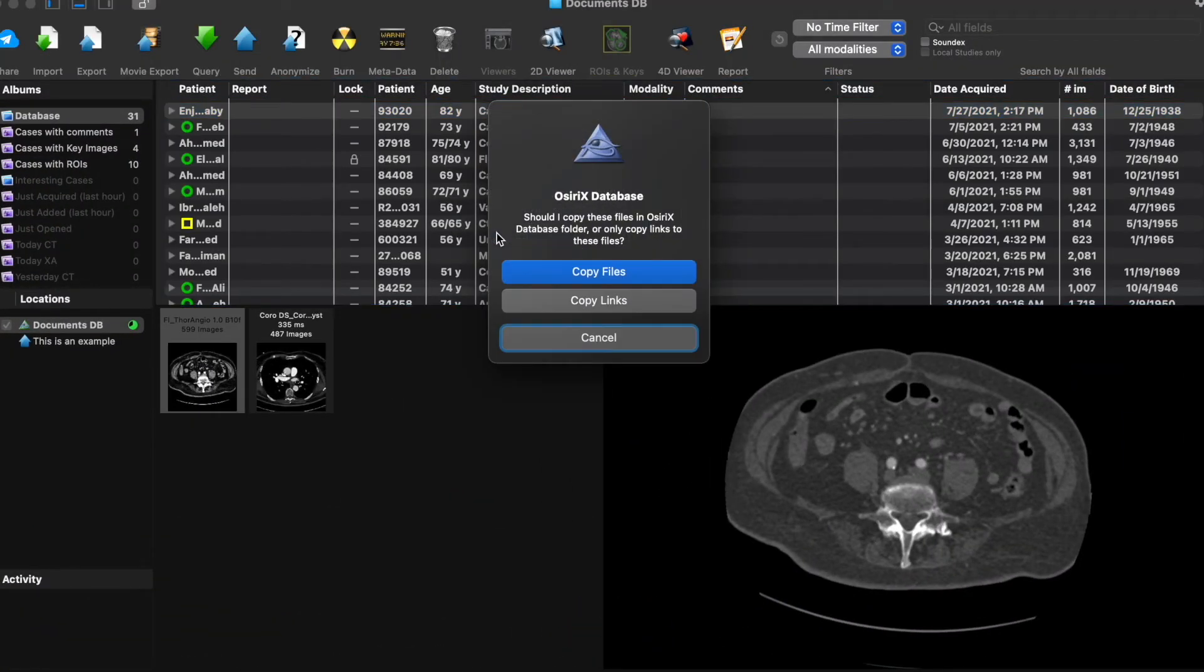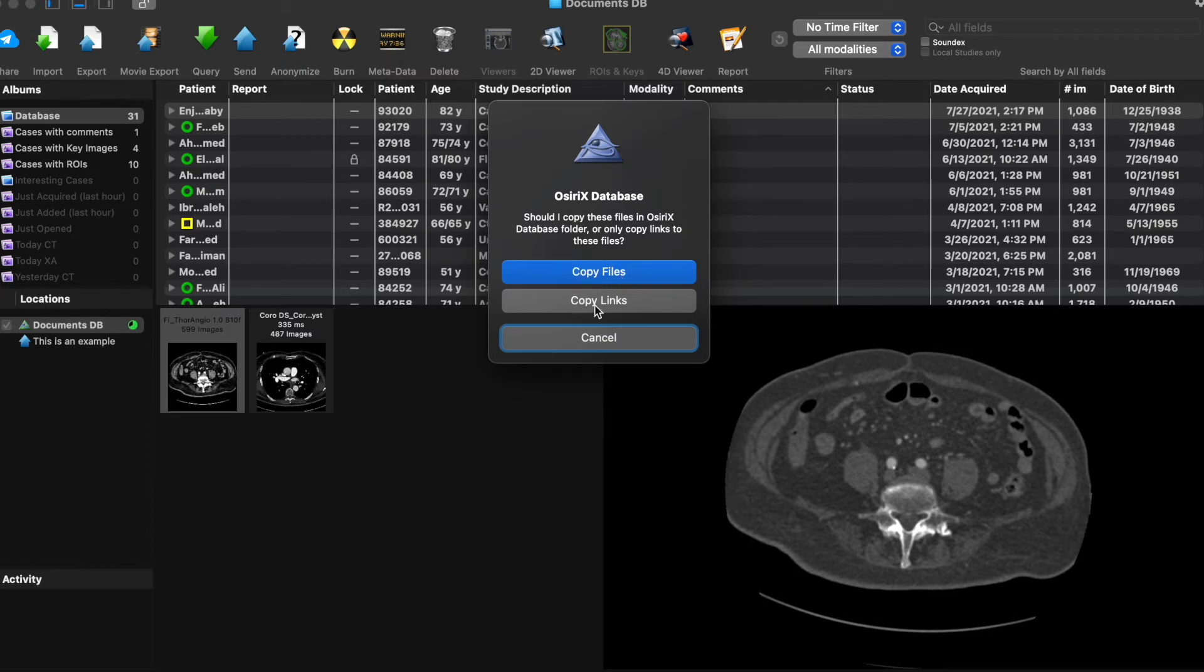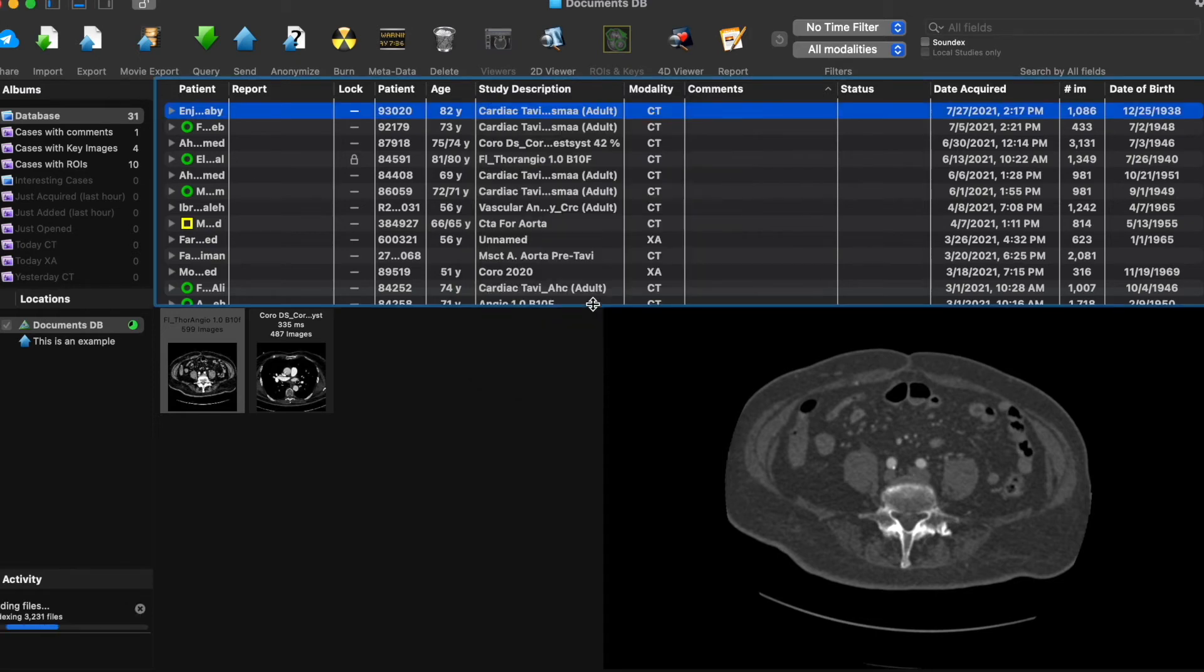And then you're going to be asked whether you want to copy these files on your local hard drive, or just copy the links if you're saving everything on an external hard disk. In my case, I'll just copy the links. And as you can see down there, you're going to see that the files are being uploaded. So that is the first step.